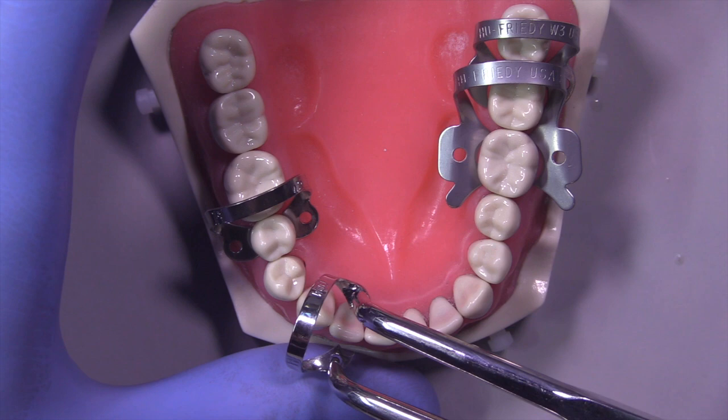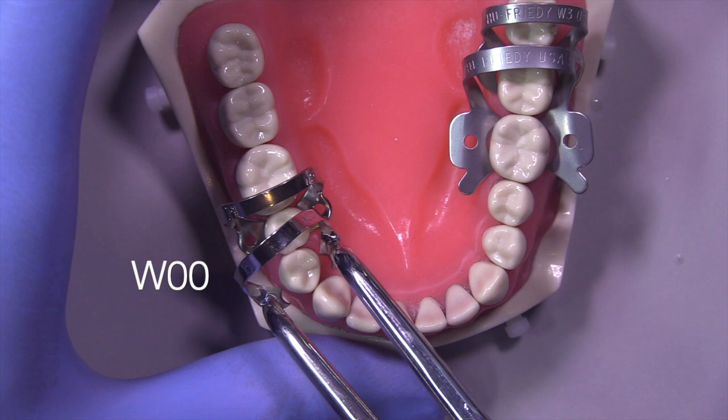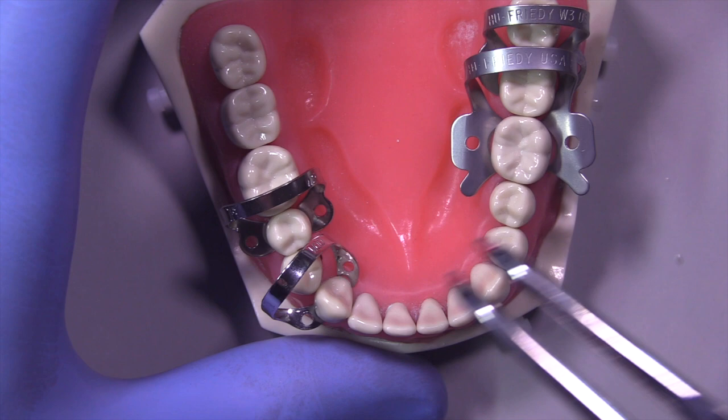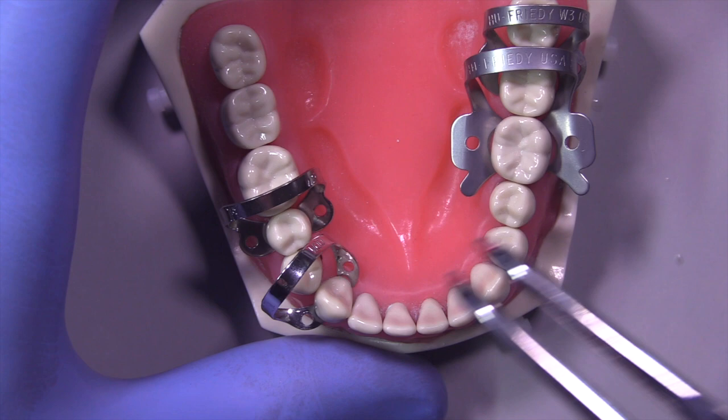And then finally I'm going to use this little double zero — the W00. You can use this on premolars, canines, incisors, any of those. I'm going to go ahead and place it here on the canine to show you how these clamps all satisfy those four demands of a properly placed rubber dam clamp.